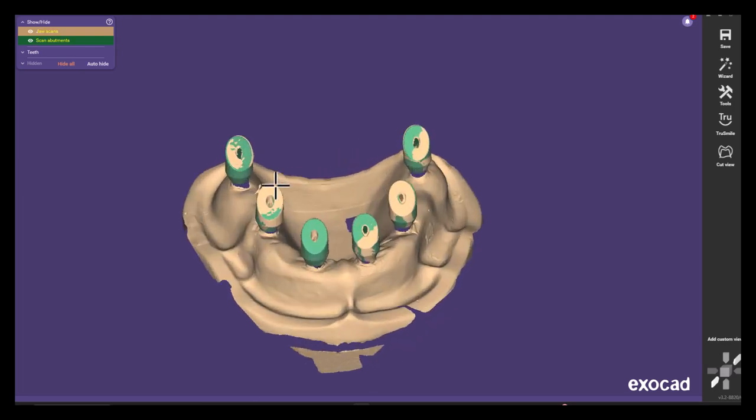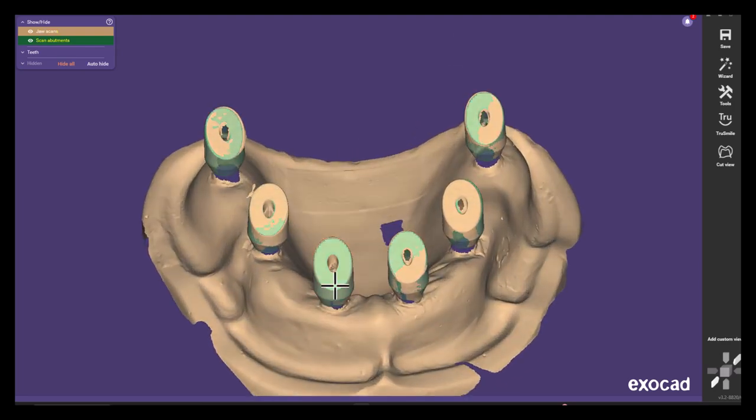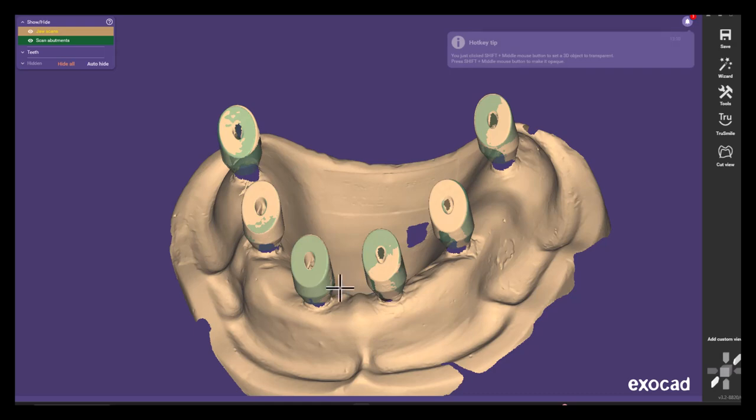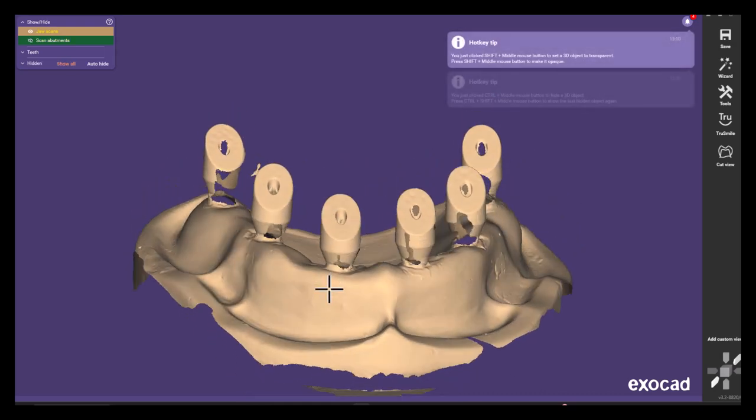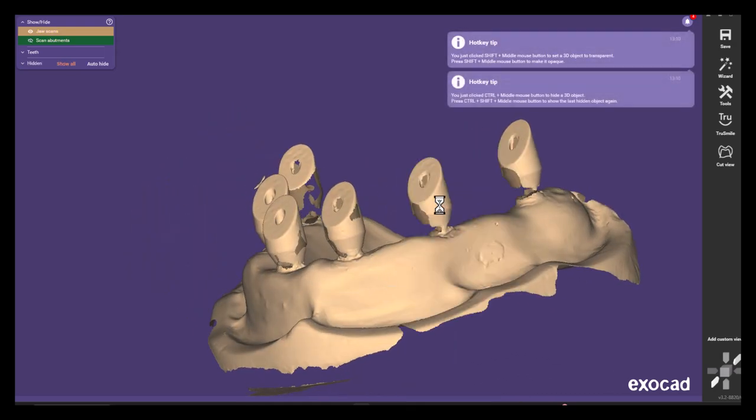But now there is some overlapping between the two meshes and to fix that just right click on the model and select edit mesh.